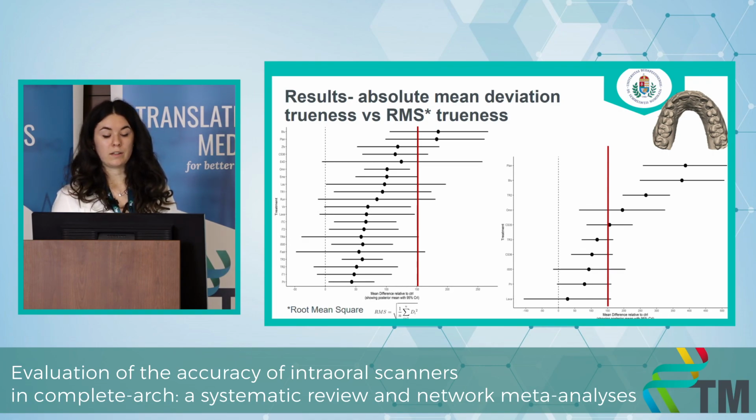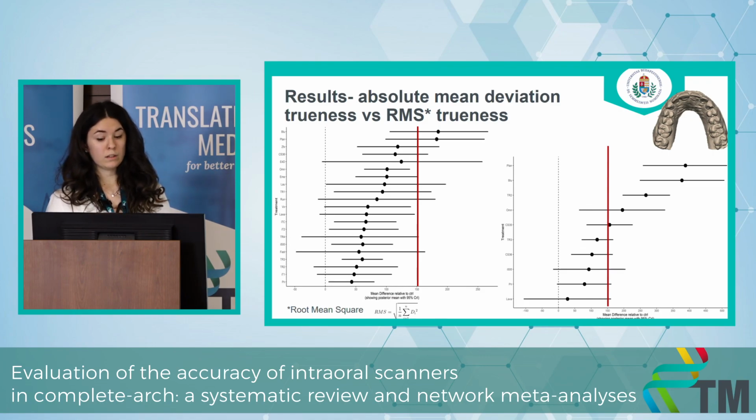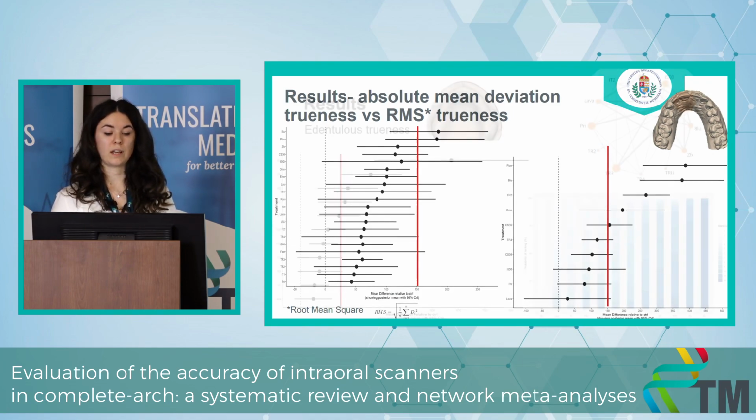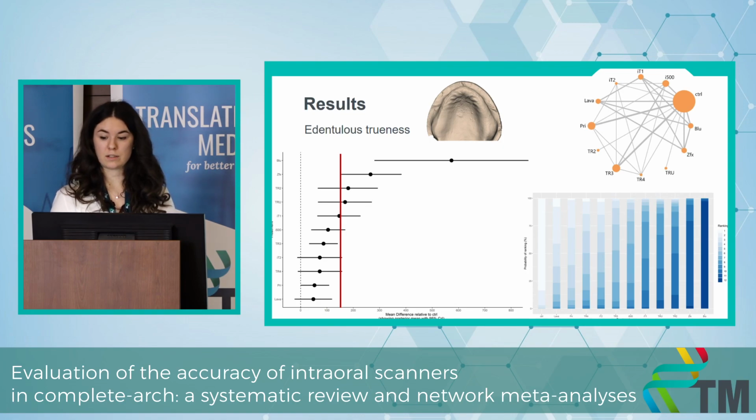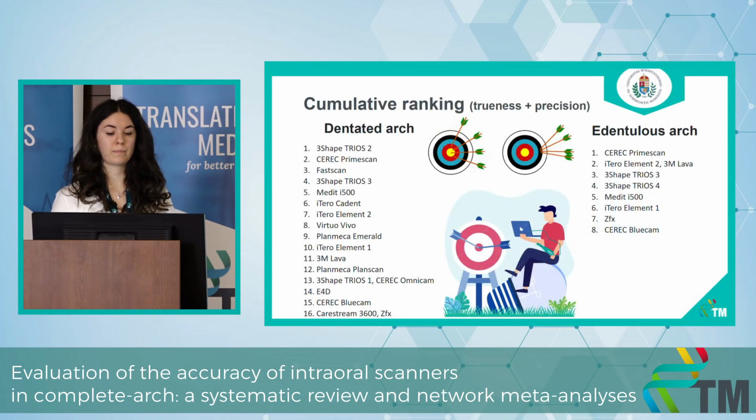Also, we highlighted a threshold in the plot, so this can show us the clinically significant areas of scanners. Also, we had different heat plots to show the ranking of these intraoral scanners, so we can make difference and make a ranking system with these plots.